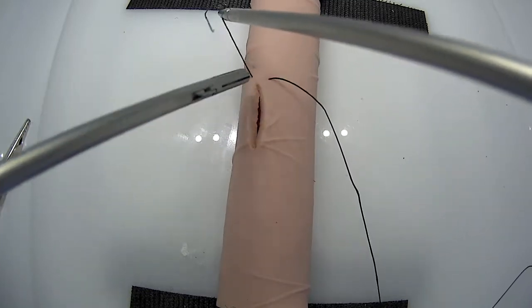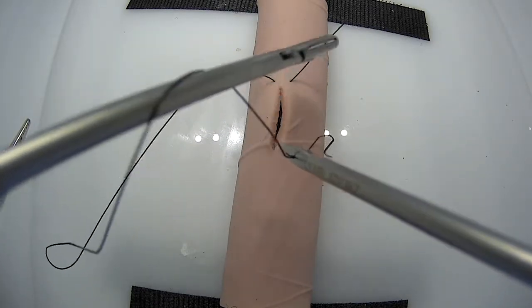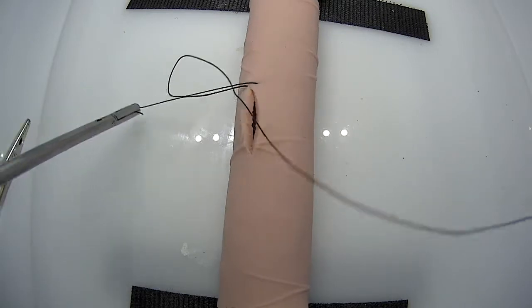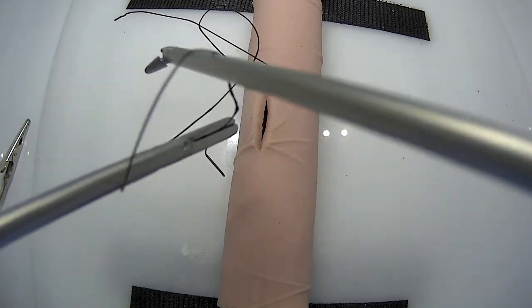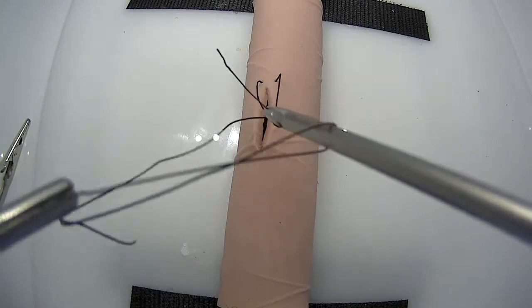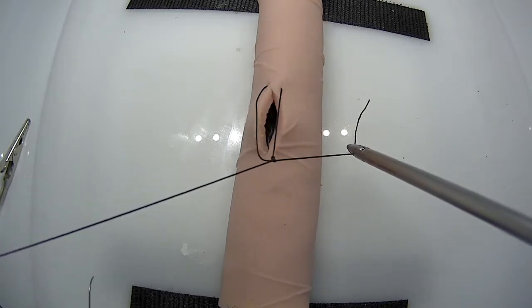We're going to then tie a slip knot, so you're going to leave the tail, do your first throw. Leave your first throw loose. Do the next alternating throw. You're going to tie this down as an air knot, leaving it like a big loop.